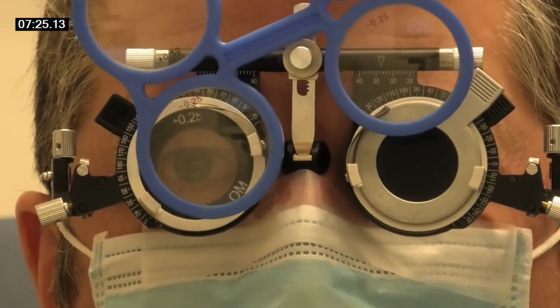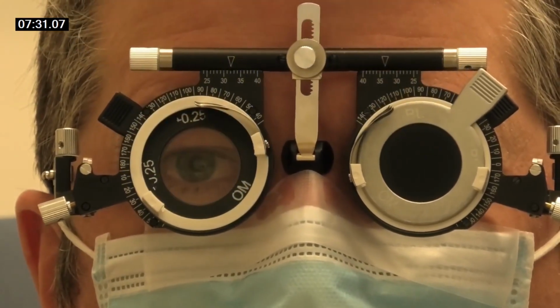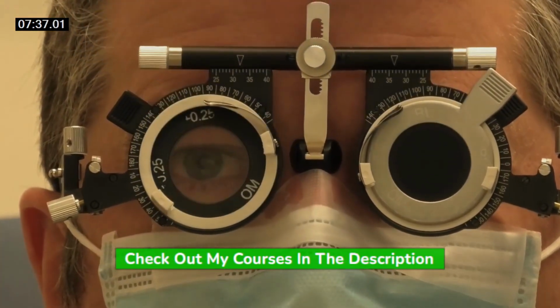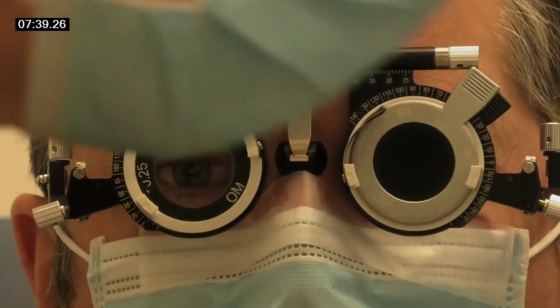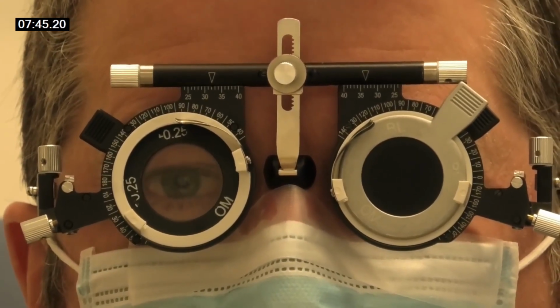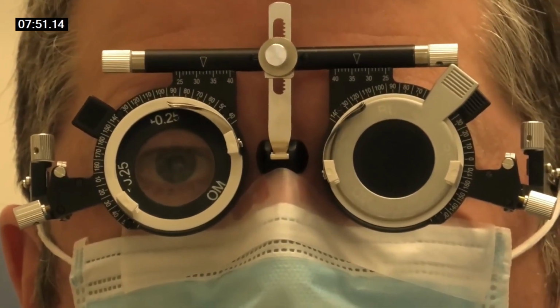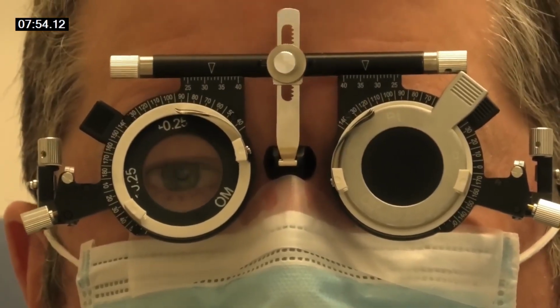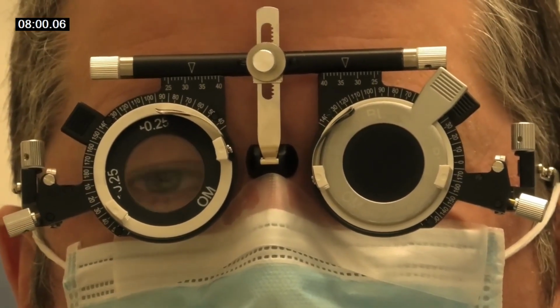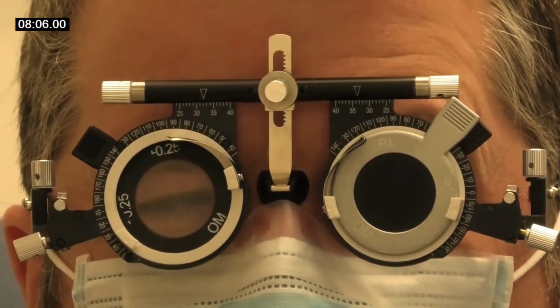Okay, and the same thing. Is that clearer with? It's about the same. About the same? About the same, yeah. Put the plus side in. Yeah, that's it. Clearer with or without? Without. Okay, so that plus one thing at the beginning. When we're at the beginning phase, before we've done cross cylinder, we're not that bothered about if we've got enough plus. So if we've got it a bit over minus, we're not bothered about it too much because the next phase we do the cylinders. And once we've done the cylinders at the end, we need to try and get the maximum plus. So that plus one test that we did at the beginning really wasn't useful. So you do that again? Yes. Makes sense.